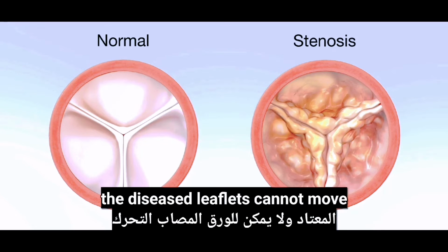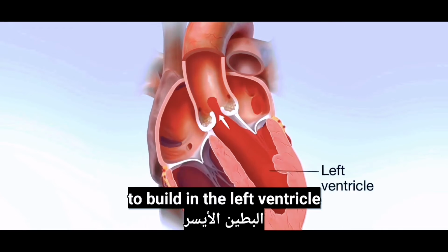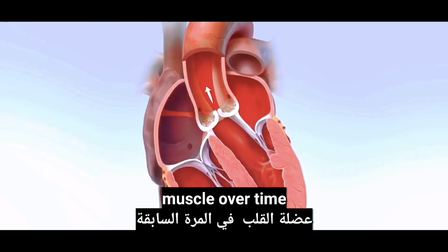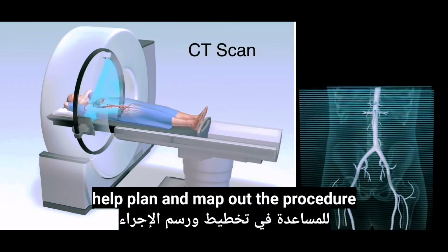The diseased leaflets cannot move correctly, resulting in poor blood flow through the valve and causing pressure to build in the left ventricle. This can damage or weaken the heart muscle over time. A 3D CT scan is performed in advance to help plan and map out the procedure.